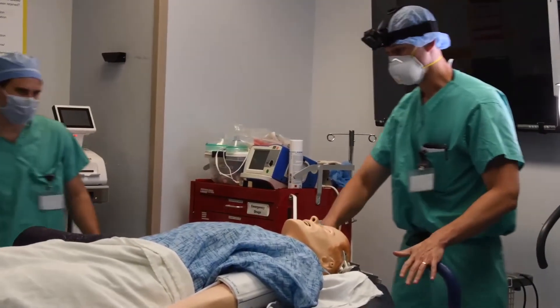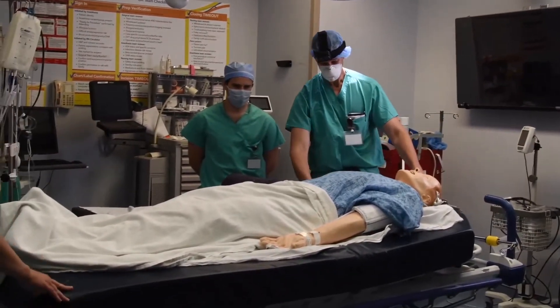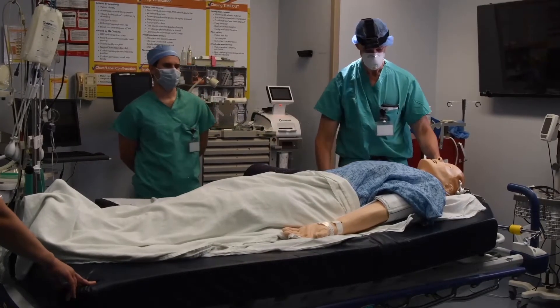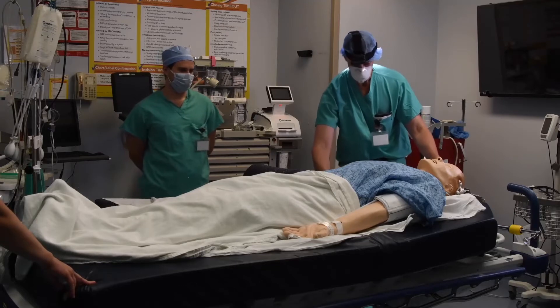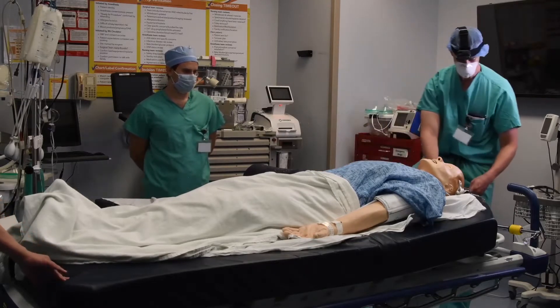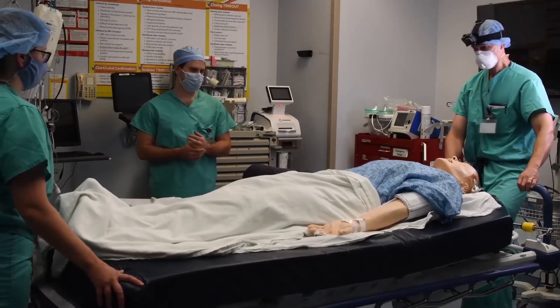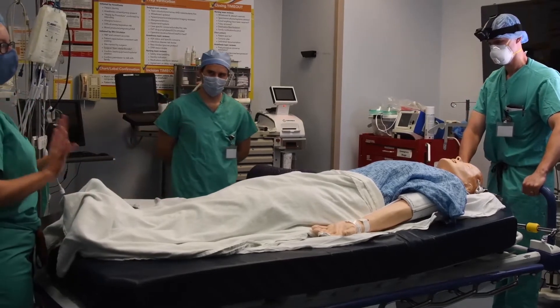When you're lining up the patient, the most important thing to note is where they are in the room and making sure their shoulders often line up with the top of the Mayfield, because that's going to be your main limiting step. This Mayfield is actually too far out — normally the shoulders would be lined up about here. We're going to have to come up a little bit with them. It's also helpful if you pump the bed up so that when you're rolling the patient you're not rolling uphill.